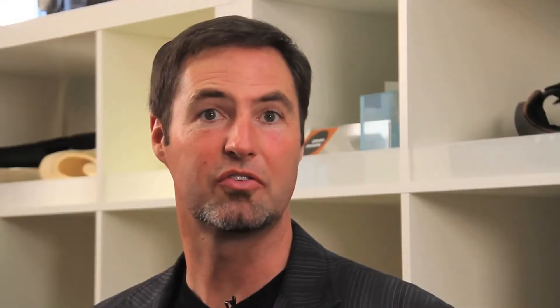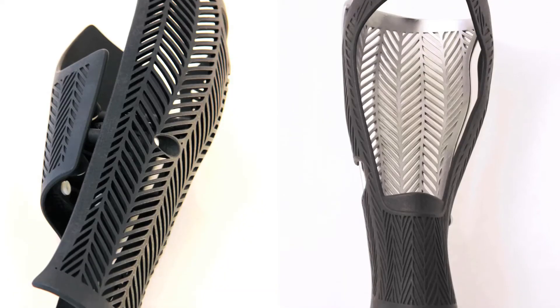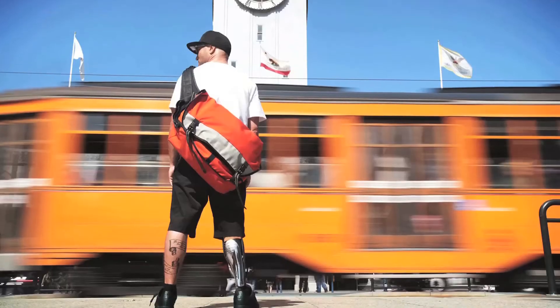Bespoke right now is working on the prosthetic fairings, which are essentially a way of making an amputee symmetric again. You're never done being sad — you lost a foot — but the symmetry was the thing that really got me, and that's what I gained back with this.